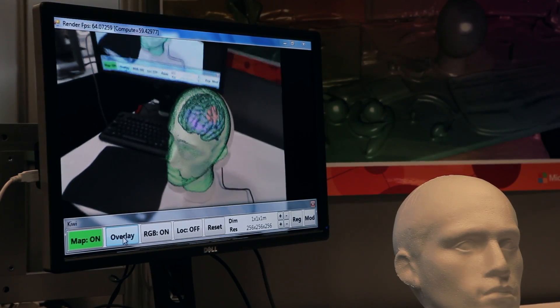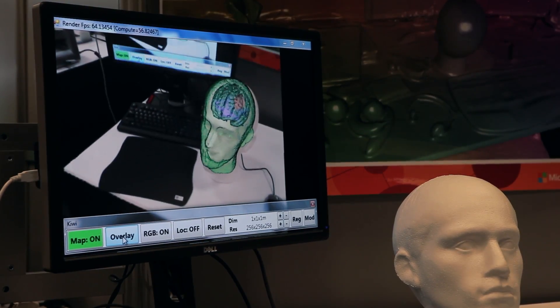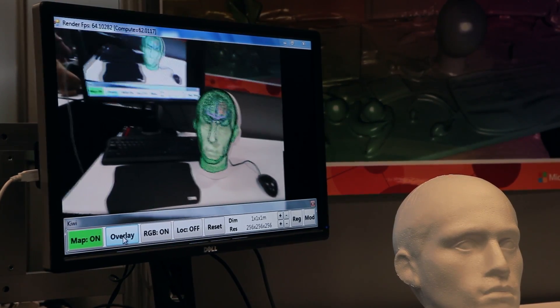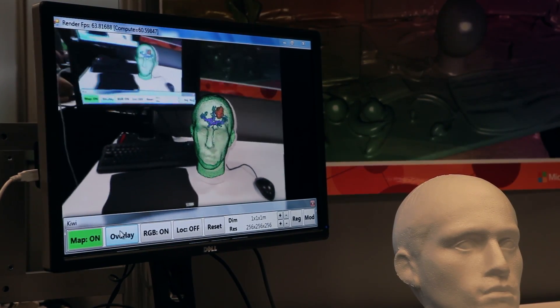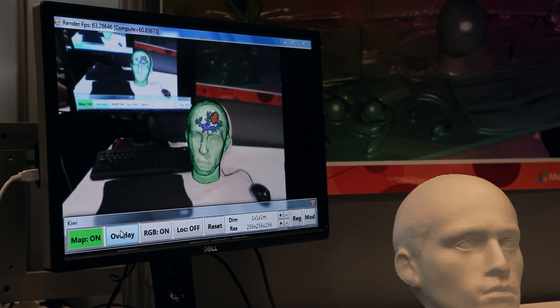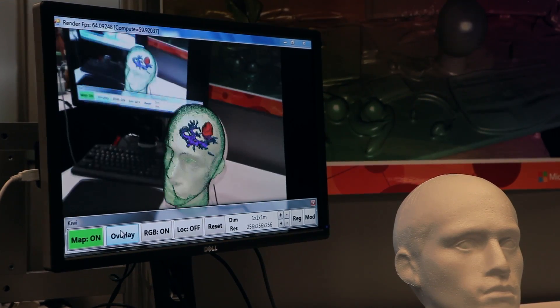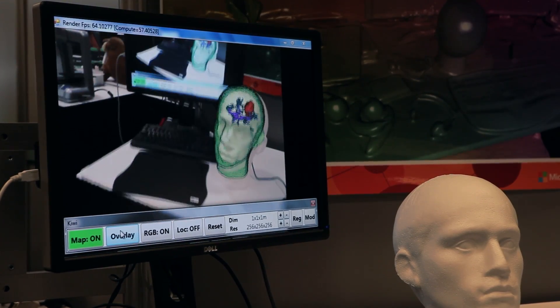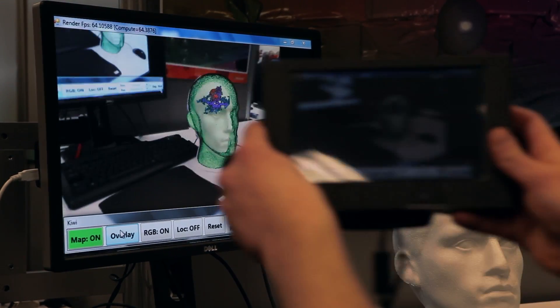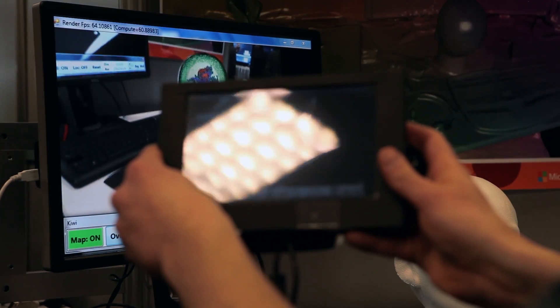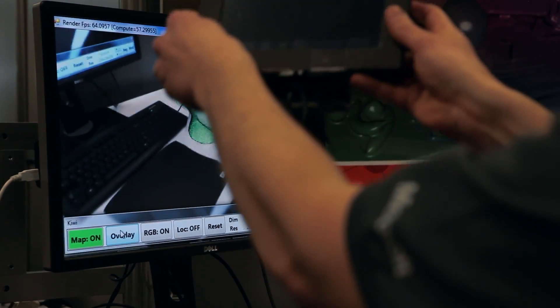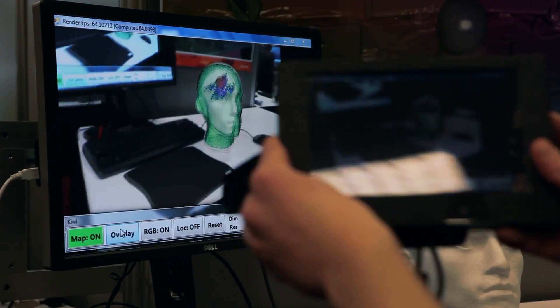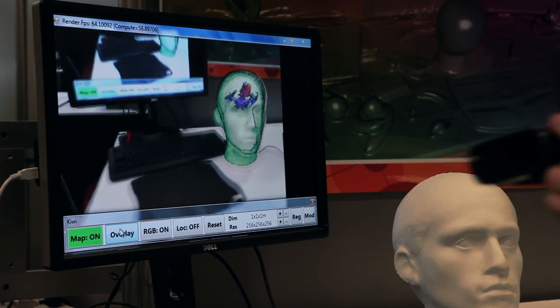So now I can see the brain of the patient and you already see this red area, this is the tumor that I want to remove. And now the physician would have the ability to walk around in the operating room and look at the patient's head from different views.